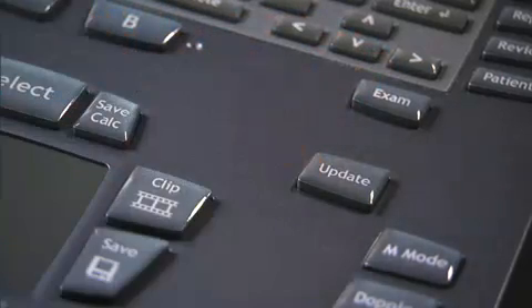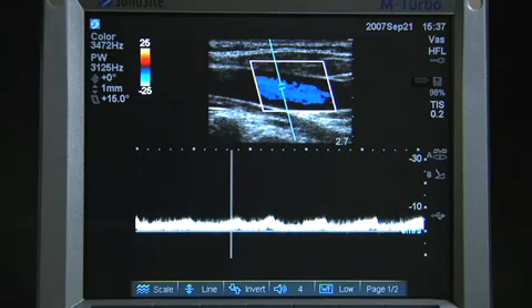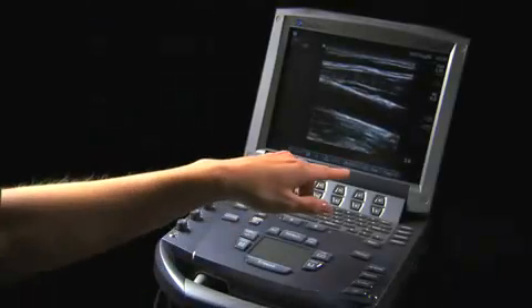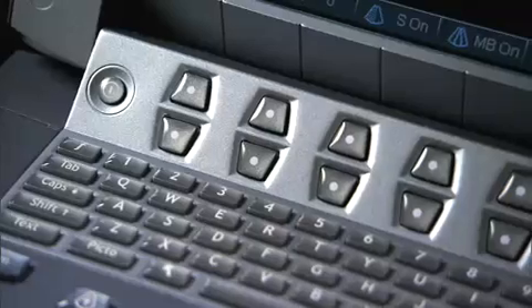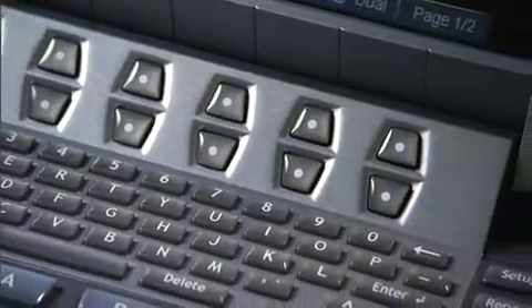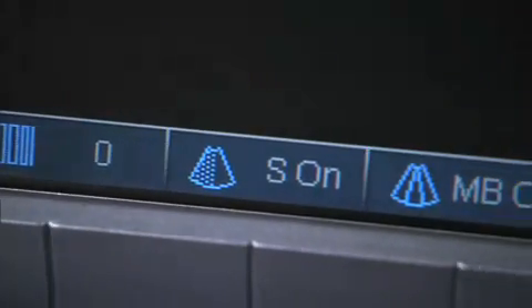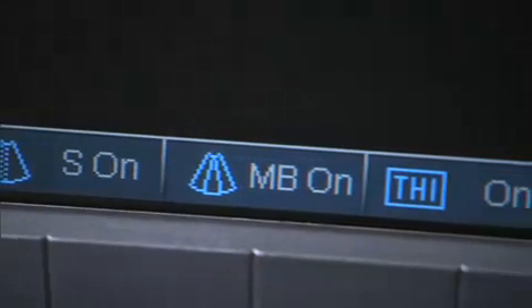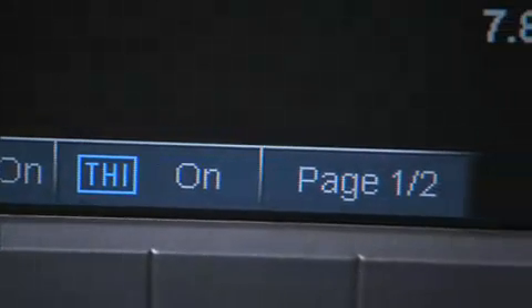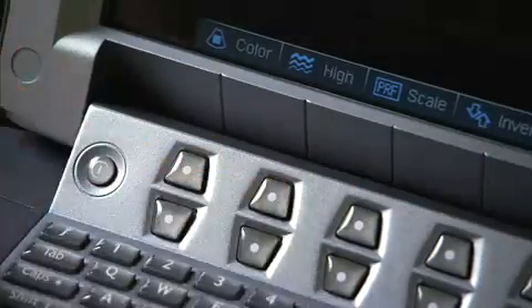Below the Exam key is the Update key, which allows you to toggle between dual and duplex screens and image modes in M mode and Doppler. At the top of the control panel are a series of six sets of two-button groups — the remappable controls, or soft keys. These keys adjust the values of each control displayed in the context menu, which varies depending on the mode or feature activated. When selected, the key will cycle through a list of values, or the up-down function can be used to quickly access the function.